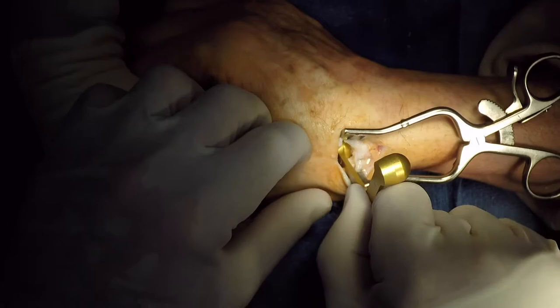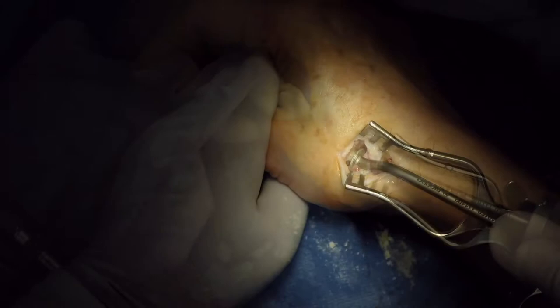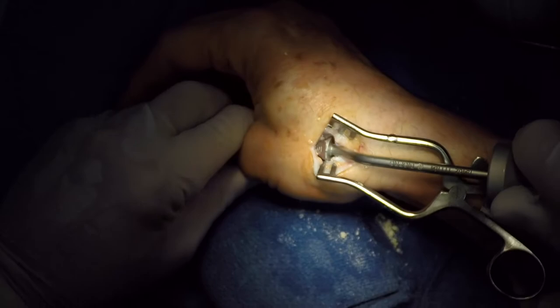This is a sizing guide that will then determine the size of the head implant, with the stem being determined separately with serial broaching as we can see here. It is important to use the maximum size so this will have better bony ingrowth and stability and minimize the chance of loosening.